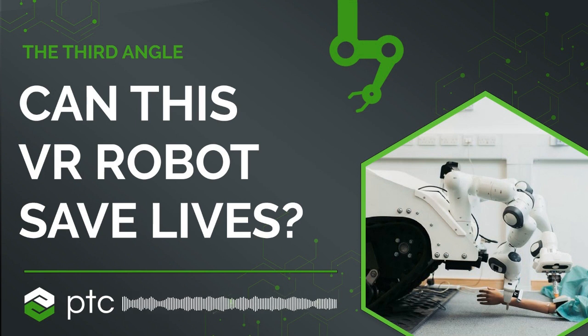The brief we were given was that it would be a remote medic, so they would be medically trained. It could actually be multiple operators. It could be an operator who gets the robot platform to where it needs to be, and then hands over to a medic to perform the triage. So you're utilising the medic for what they're good at, the medical procedures. Yeah, the NHS has specific teams for large-scale mass casualty incidents.